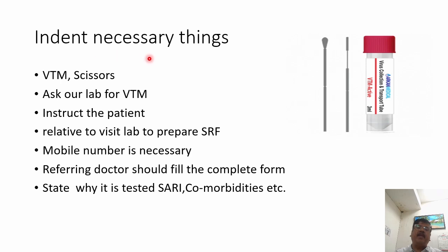Those doctors who are working in the ward should get trained themselves for collection of samples. Already we have trained some doctors. The necessary things, like viral transport medium, should be indented; it will be available in the microbiology laboratory. Depending upon the swabs, swabs can be broken at a weak thin point. But if such swabs are not available, we have to use scissors. Then ask the lab for VTM.